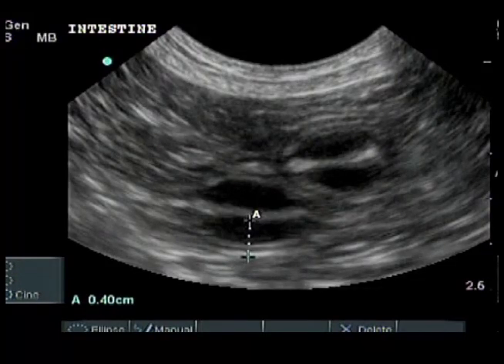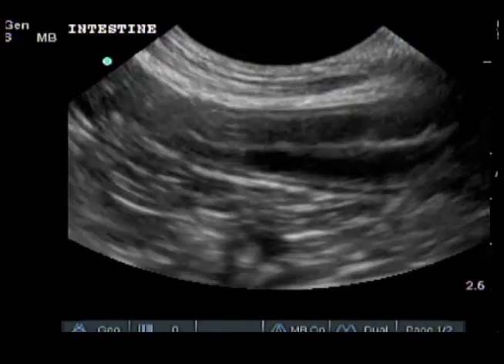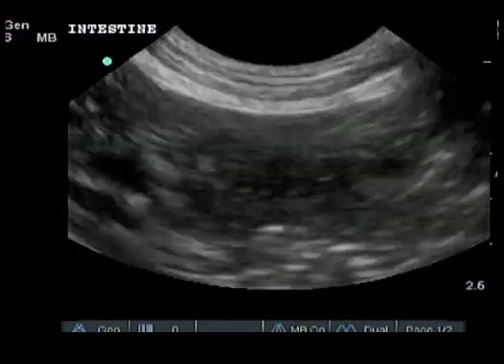If you do not see an intestine to measure near the spleen, you will find some later in the exam as you move the ultrasound beam from the left adrenal to the urinary bladder, or from the urinary bladder to the right kidney.